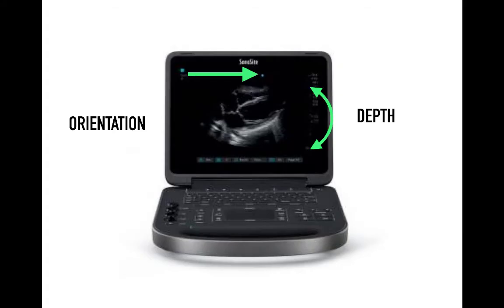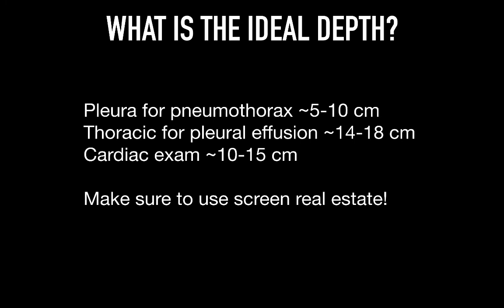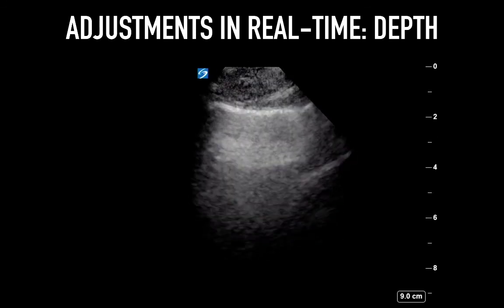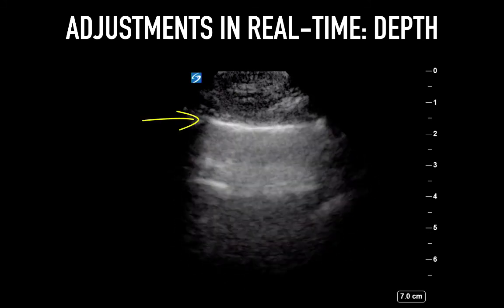On the Edge screen, depth is displayed on screen right and the marker is displayed at the top by a blue dot. On the Xport, orientation with the screen marker and depth are manually adjusted on screen right. Ideal depth really depends on what you're looking at — optimize your screen real estate. For pleural pneumothorax, 5 to 10 centimeters; thoracic space for pleural effusions, 14 to 18 centimeters; cardiac exam, 10 to 15 centimeters. Here is a real-time adjustment starting at 15 centimeters where reducing depth results in much better visualization of the pleural line.